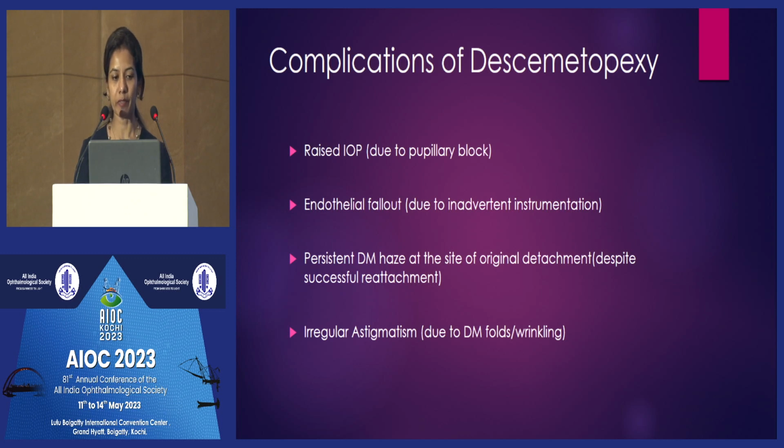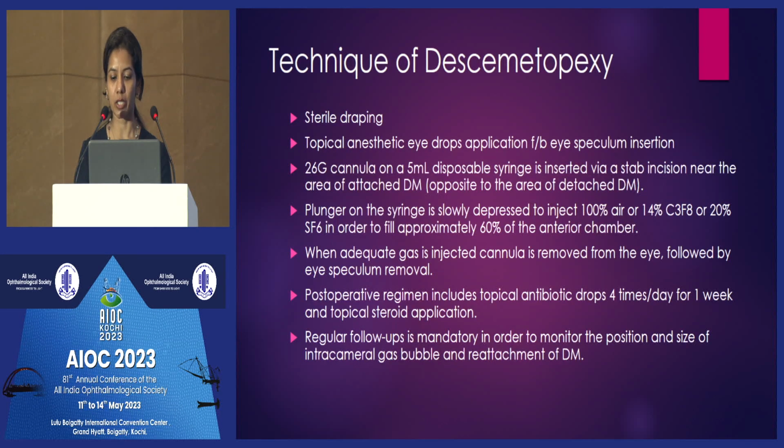So now once we've done the air injection, what we do is we typically tell the patient to lie down at least for an hour in the OR or the recovery room, and then we remove the patch after an hour or so to reassess whether there is a full chamber air and whether the patient is having too much pain. Then we would release some air. We could burp a little air on the same day. If the patient is comfortable, we send them back, advising them to have a supine position for the entire day.